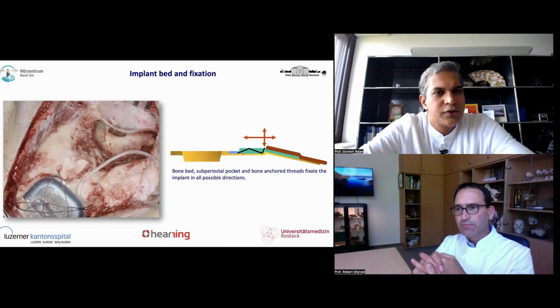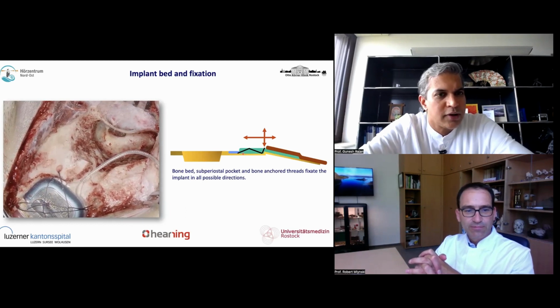So you do this for children and adults? Yes, always. I also suture it down, but in children, I also use non-resorbable sutures. No, resorbable.